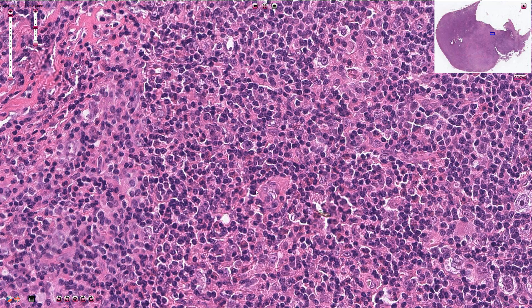At higher magnification we can see multiple eosinophils with eosinophilic granules in the cytoplasm and bilobed nuclei. This is quite common in Hodgkin lymphoma.